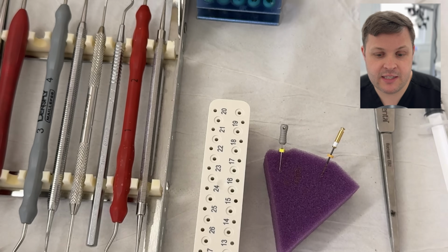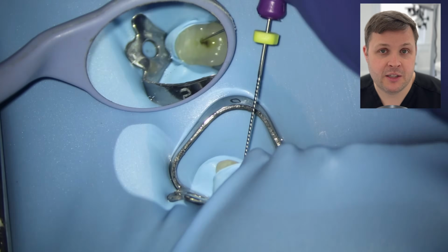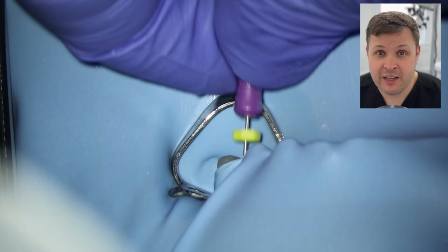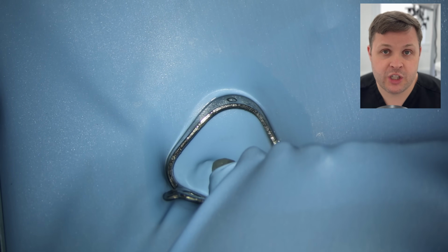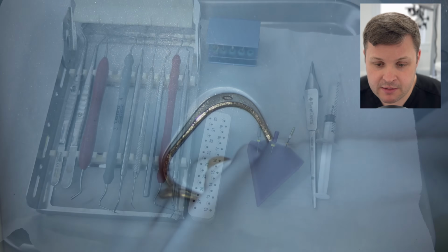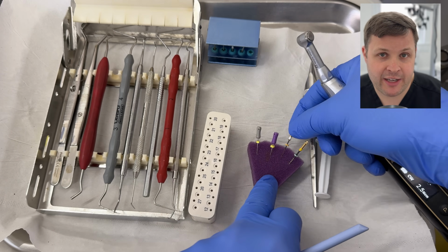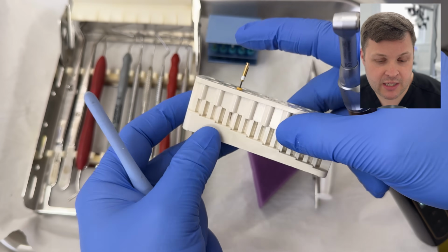So a lot of these times you're probably just not that far away from 0, and so again, it's another vote for patience and taking your time. Same again though, we're just going to get past that ledge, give a bit more of a clean out with our hand files, and then I'm going to try and automate the removal of this ledge a little bit using a glide path file.